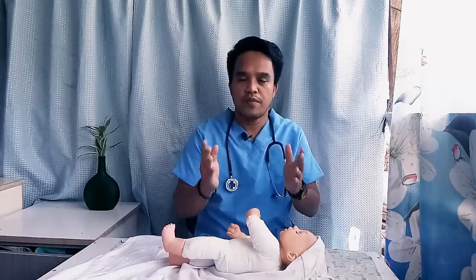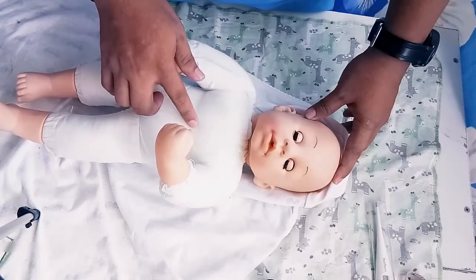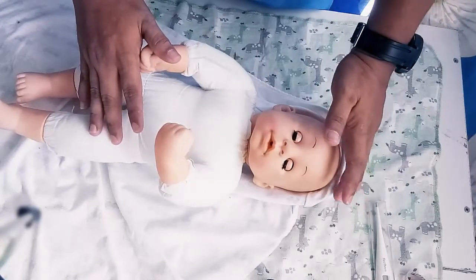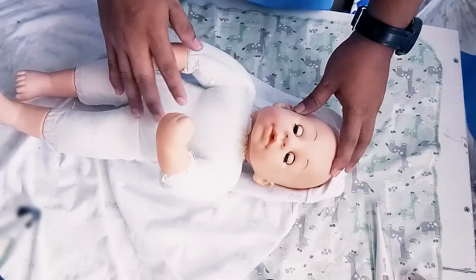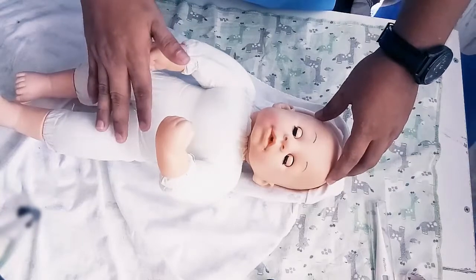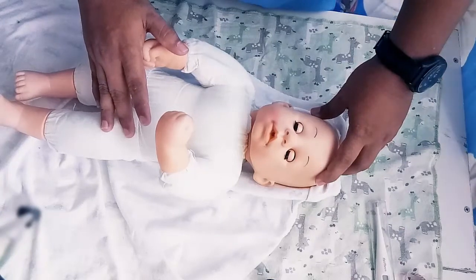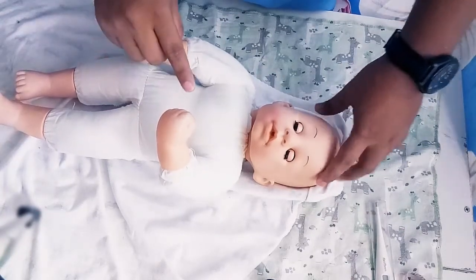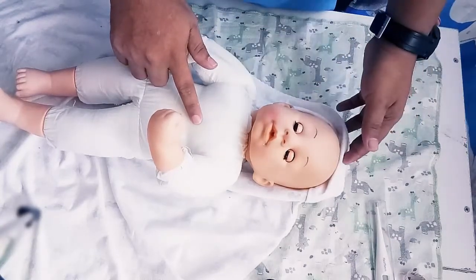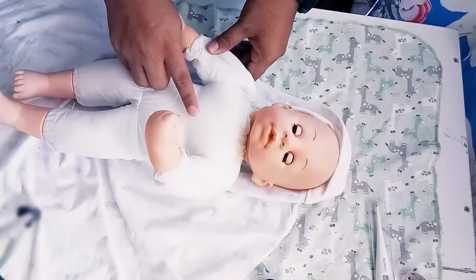We also look at the chest for any chest retractions. It literally looks like the skin has been pulled over the ribs and you can see the ribs very well. This infant does not have either of these things. To count the respiration, we're going to count one full minute of the rise and fall of the chest. Infant breathing pattern is irregular. Infants like to breathe abdominally, so if you're having trouble, just lightly place your hand on the chest and feel the rise and fall. Be careful not to distract the infant and get them crying. Let's count the respiration of the baby.